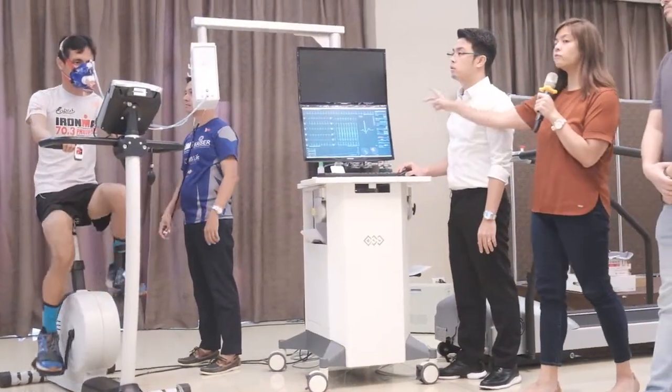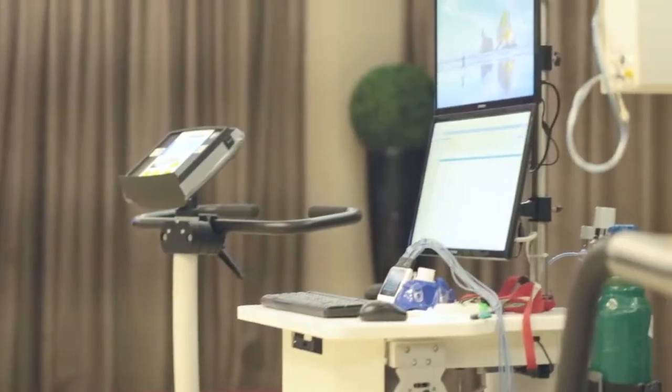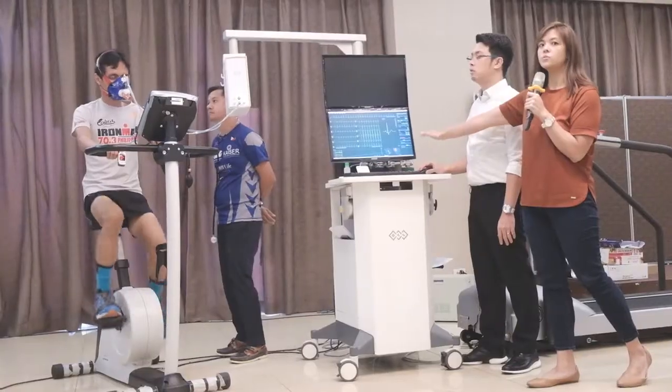The actual CPET, we have 2 monitors. We're just showing you one. The other one should be the ECG monitoring.